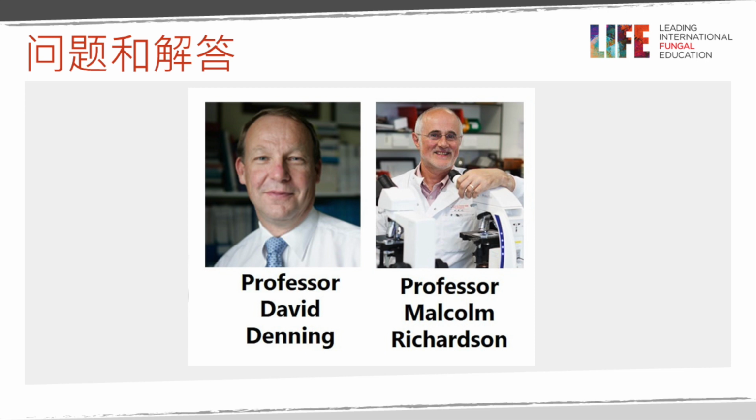I don't know if it works for rarer species of Cryptococcus, which are rare causes of meningitis, such as albidus or uniguttulatus or laurentii.